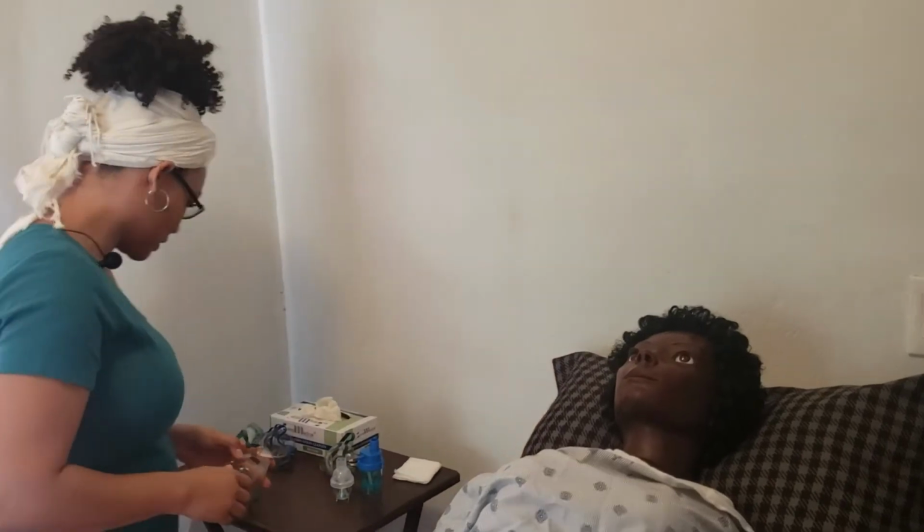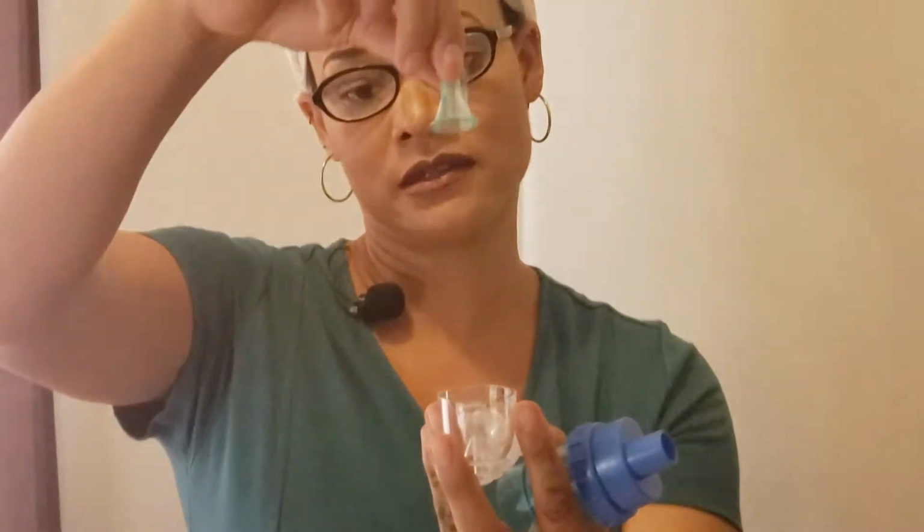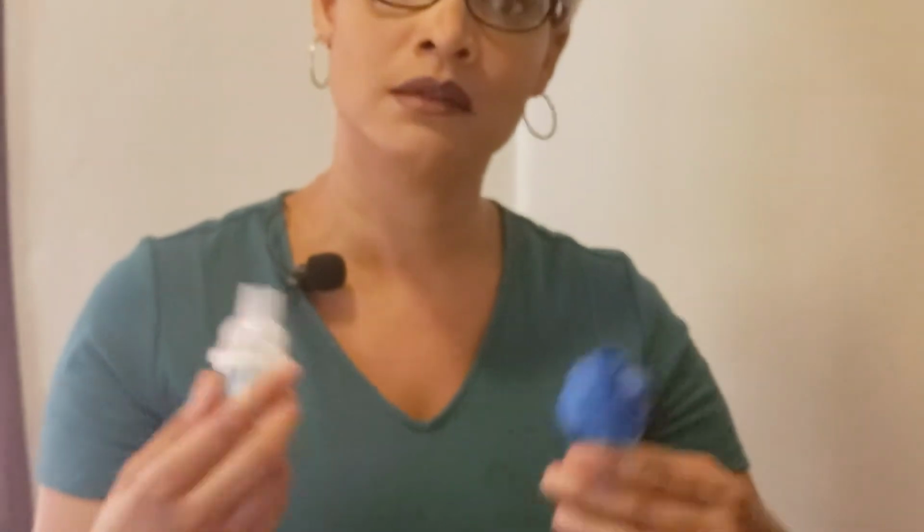Next, we can discuss issues of giving medications, because you may be familiar with them in terms of an asthmatic patient receiving medications. These little bottles come with 3 different parts. There's the top that attaches to the mask. There's the bottom that holds the fluid. And then there's that third little piece that helps to cause the aeration of the medication. You have to make sure that all 3 parts are together in order to make sure that it works. Otherwise, if you just have 2, it will not make that humidified medication.